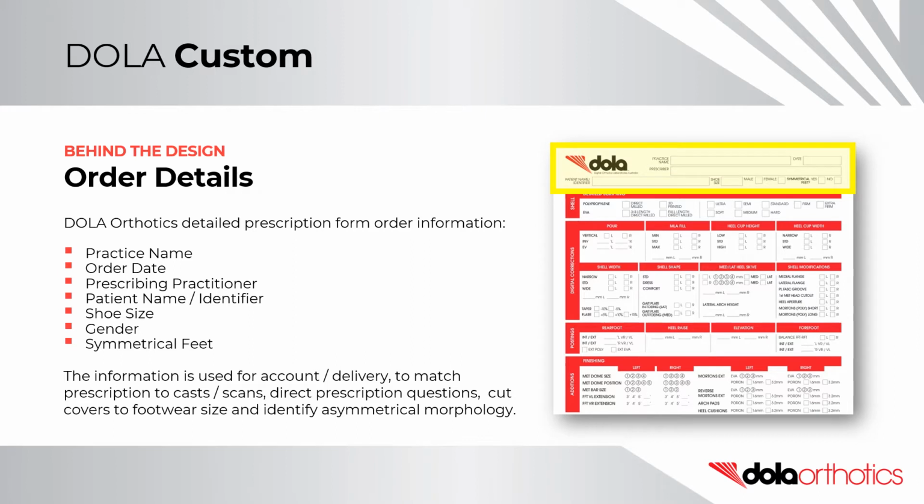The top of the DOLA Custom Detailed Prescription Form collects vital order information, footwear details, and foot symmetry information on the patient. The details collected include the practice name, for account and delivery details, the order date, for order tracking and turnaround times. The prescribing practitioner allows any prescription questions to be directed to the appropriate prescriber and maintains confidentiality.